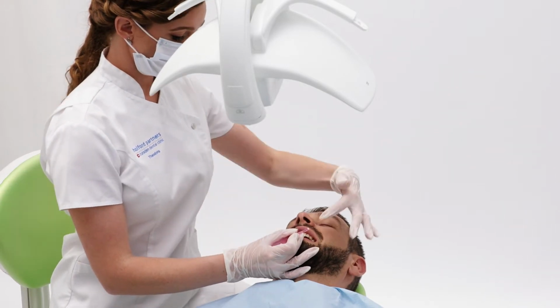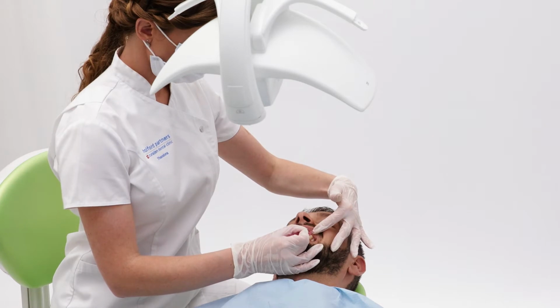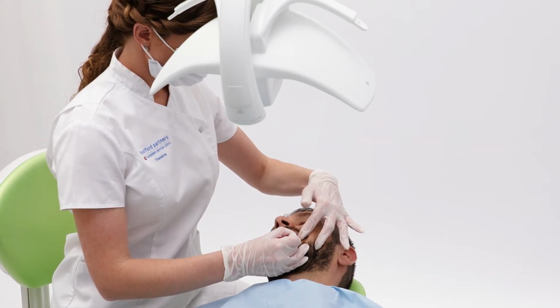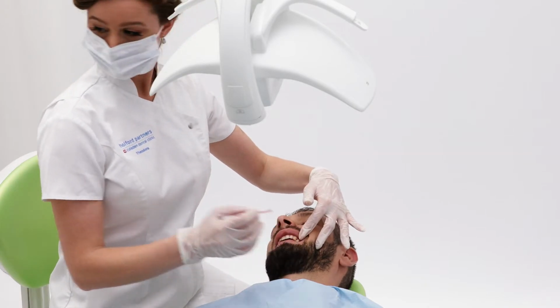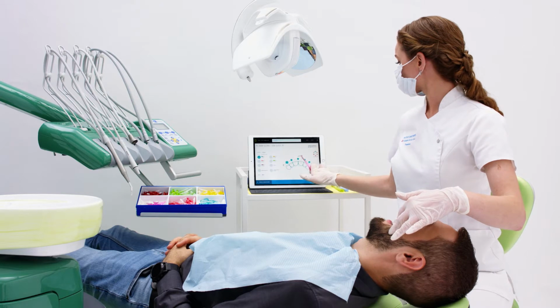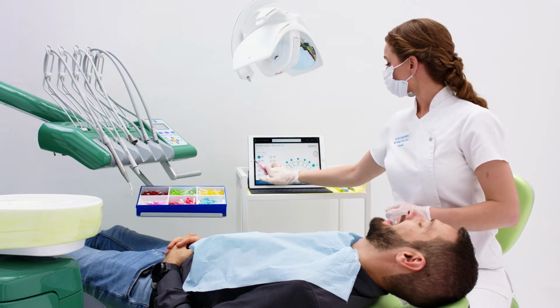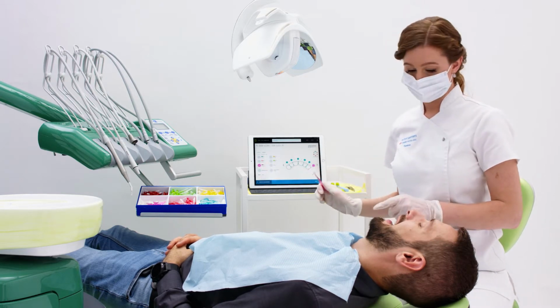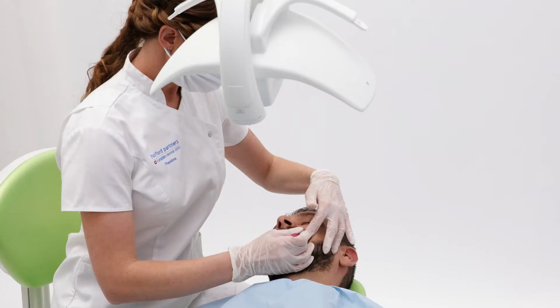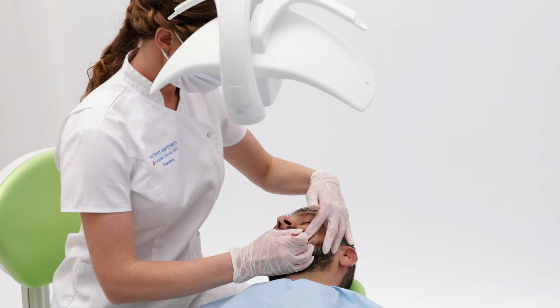I then continue to the next sextant, that being the upper anterior teeth. As you can see here, the probe is very simple, quick and effortless to use.